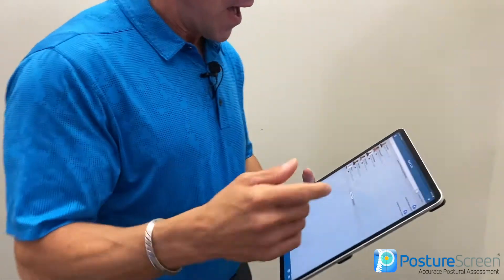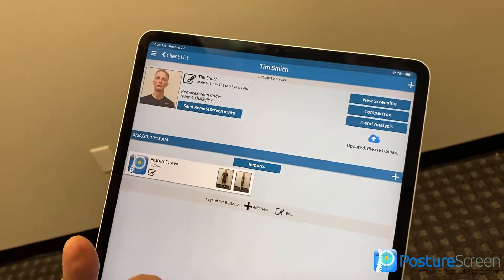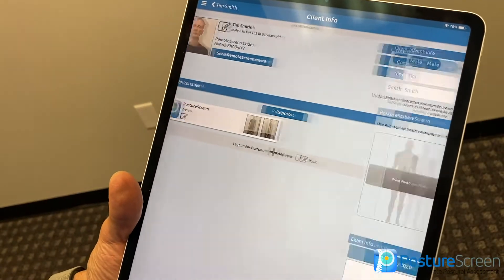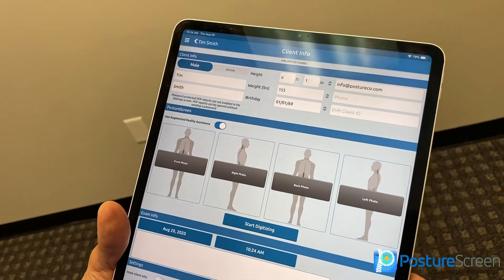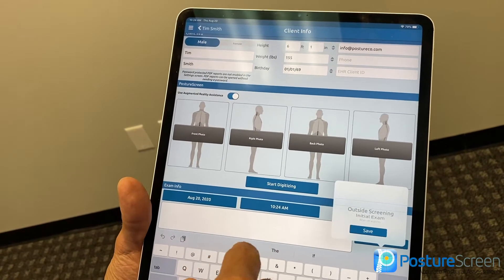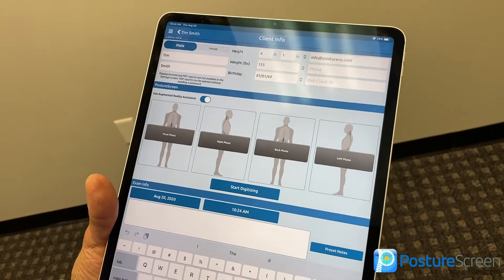With that being said, and hopefully you like my sense of humor, otherwise I get bored doing these videos, I'm going to go ahead and do a four-view assessment. I already started Tim on this, so I'm not going to go through how to put in his information. What we're going to do is hit new screening, then posture analysis. It carries over their information. If you need to update weight or notes, go ahead and do so. You can always put clinical notes in here that do not get sent to the patient.